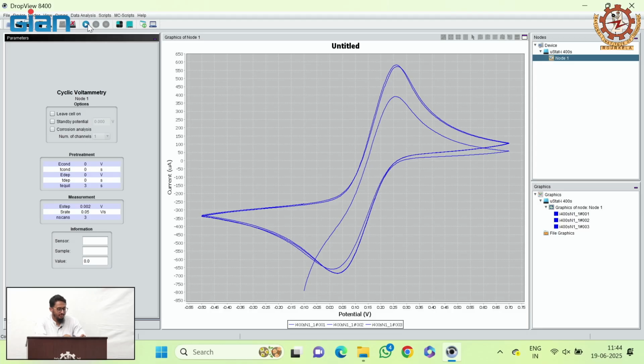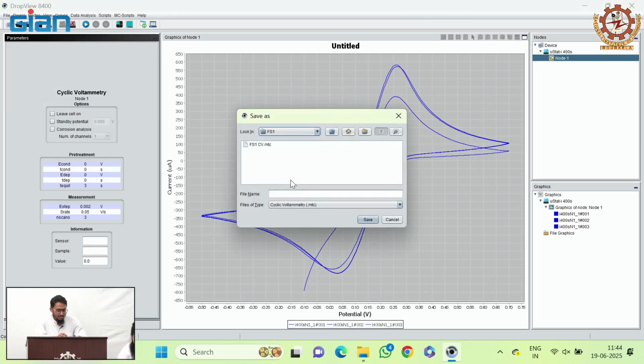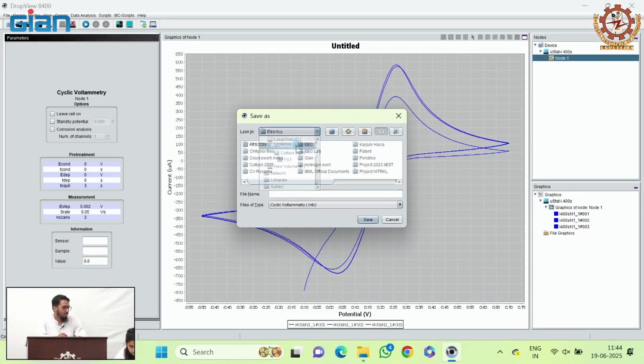Completed? Complete. So now the first step for checking the working electrode is done. The curve tells us that the working electrode is fine, and this working electrode, just to remind you, is coated with platinum. So the second step would be to wash the potassium ferrocyanide, which is the cleaning step. For this cleaning step we will be using DI water. After the cleaning step we will do electropolymerization to deposit glucose oxidase on the surface of the working electrode.